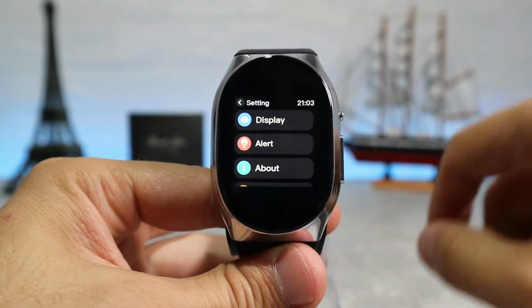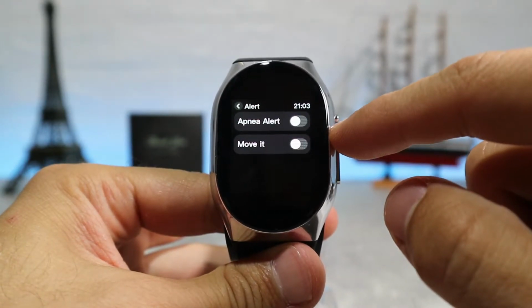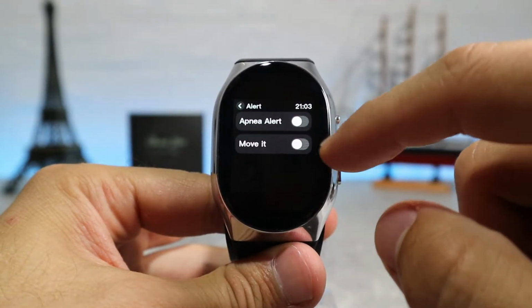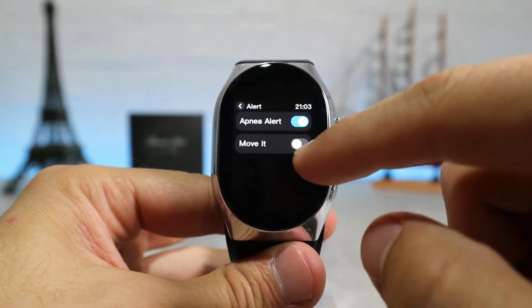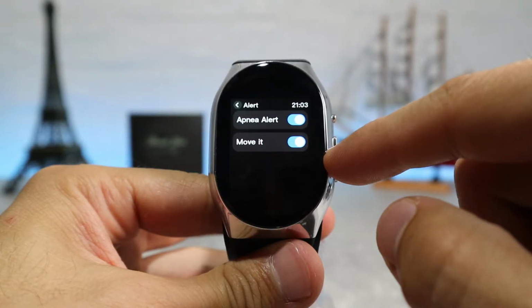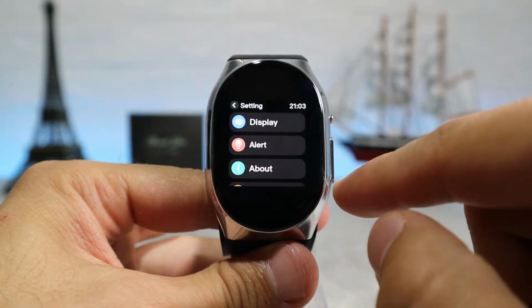Next, we have alerts enablement. 2 alerts are available: apnea alert and move it. The former will trigger if you suffer from sleep apnea, while the latter if you sit too long on your chair. Like the alarms, the watch will vibrate and show a visual reason for the alert.